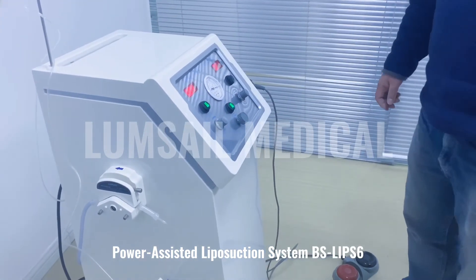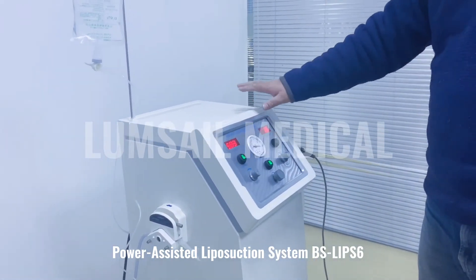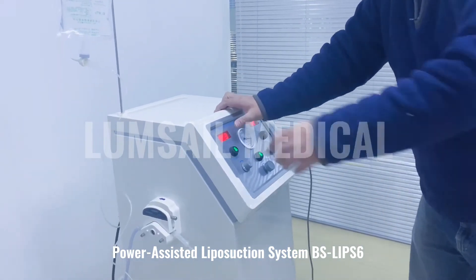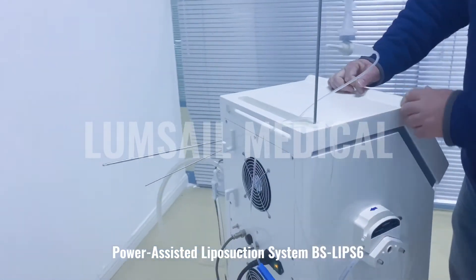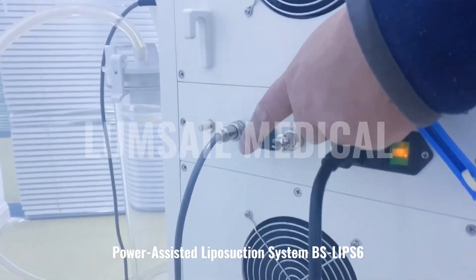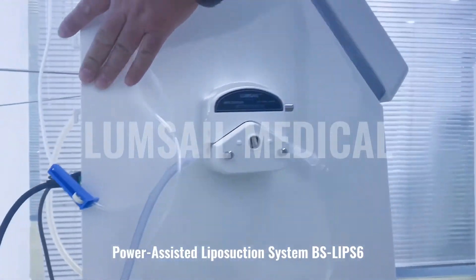The last function is the suction, which is provided by the vacuum pump inside. For this model, we have two pumps, so you can turn on or off the additional one. With the pump switch, you can turn it on or off. When both are turned on, it has two pumps working at the same time.